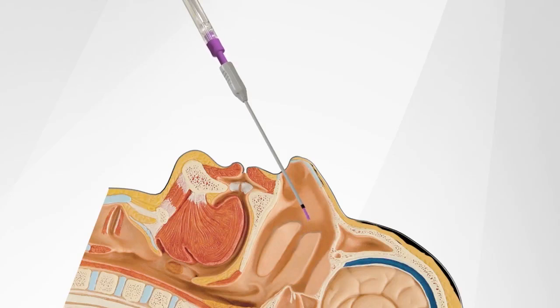Withdraw the inner catheter to straighten the device. Reposition the catheter to achieve a steeper incline relative to the bridge of the nose by lowering the hub and syringe closer to the patient's lips. Make contact with the nasal bone, withdraw 1 centimeter, deploy inner catheter, and repeat injection of 1 cc of 2% lidocaine.